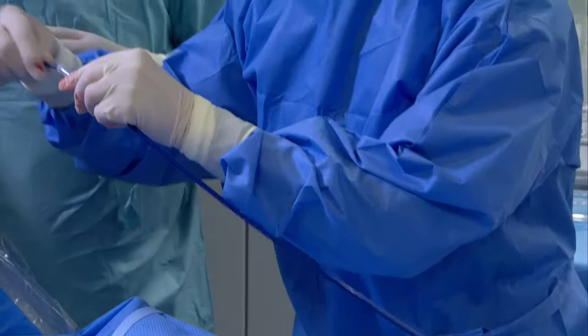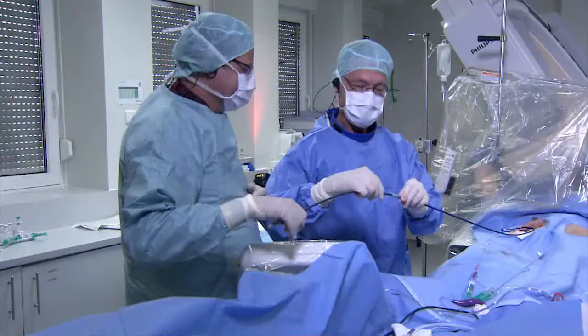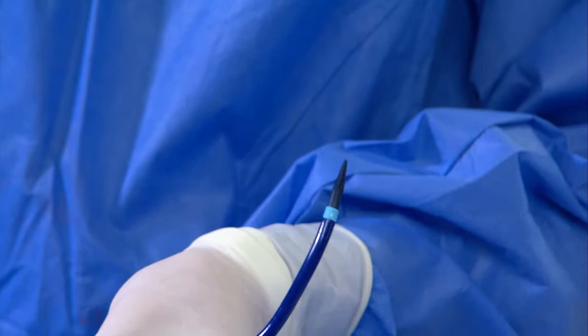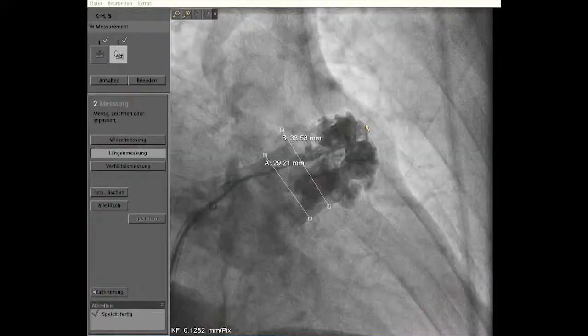The Amulet sheath is confirmed. An imaging question is raised: what fluoroscopic view is used for measuring the LAA? The answer is RAO caudal — approximately 30 RAO and 20 caudal. That is the standard view used each time, as it consistently gives the largest diameter with very few exceptions.